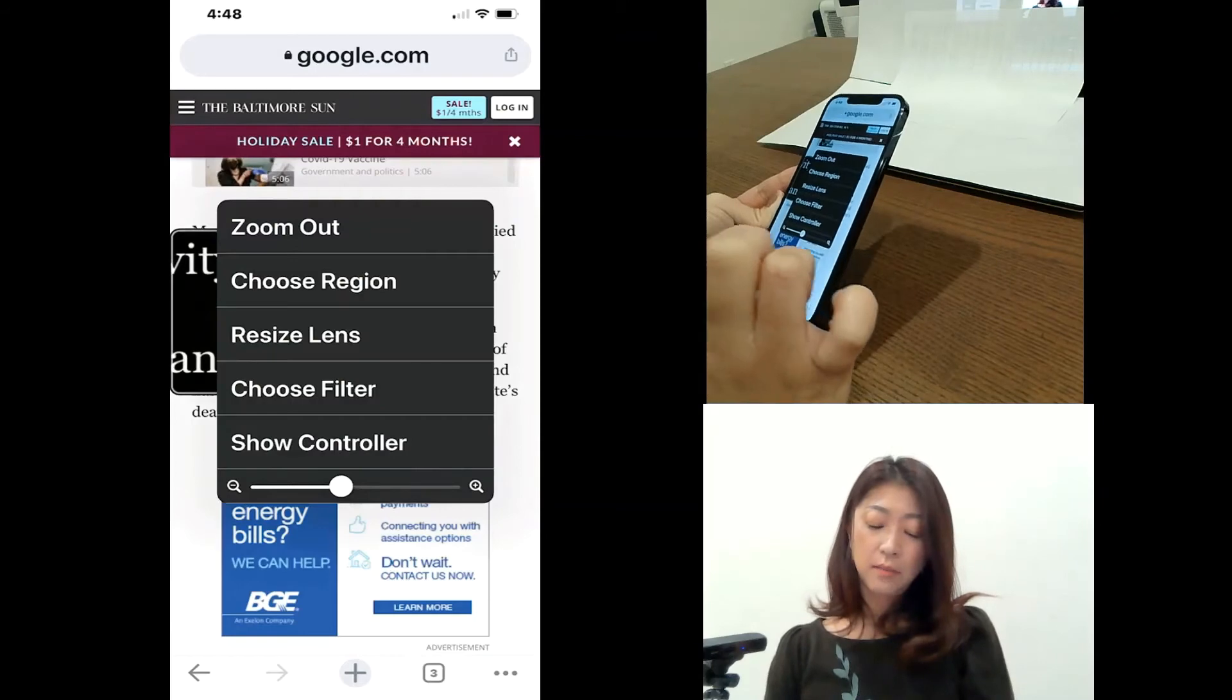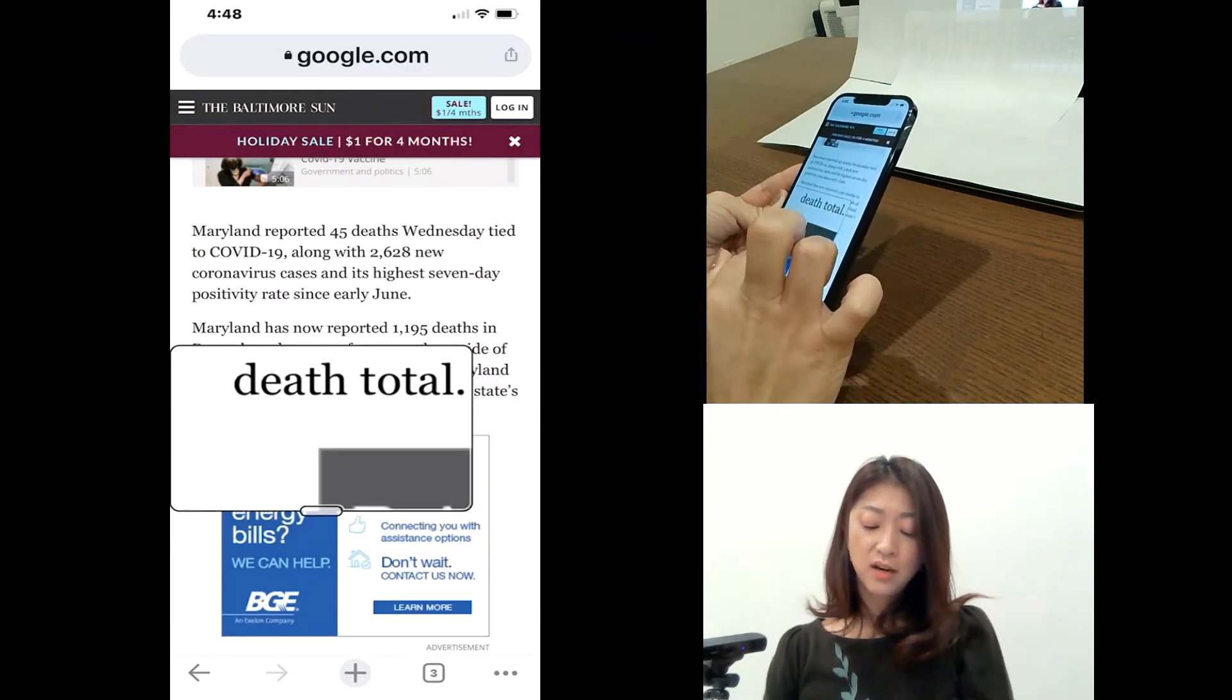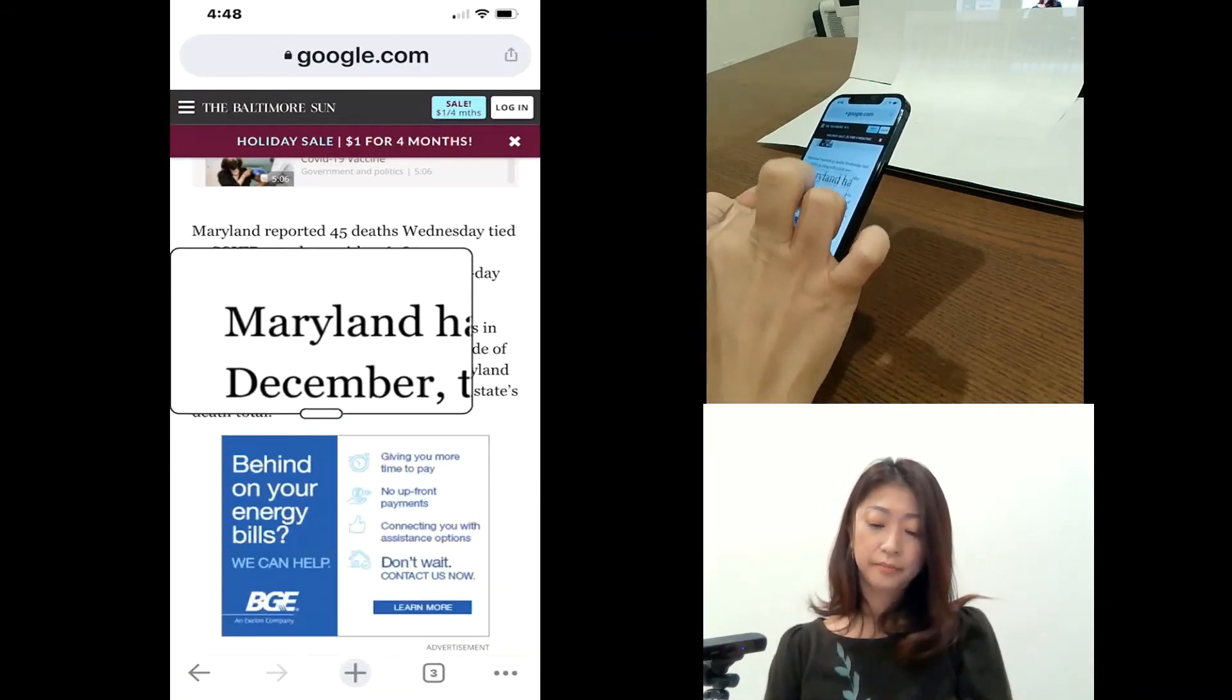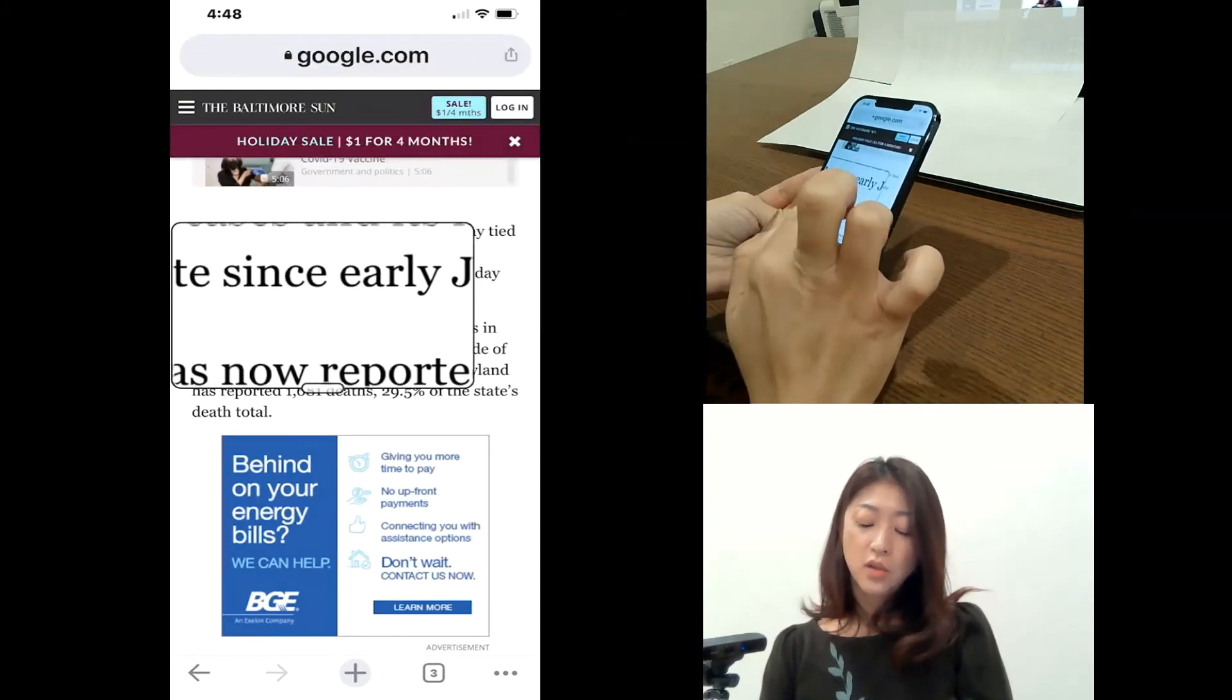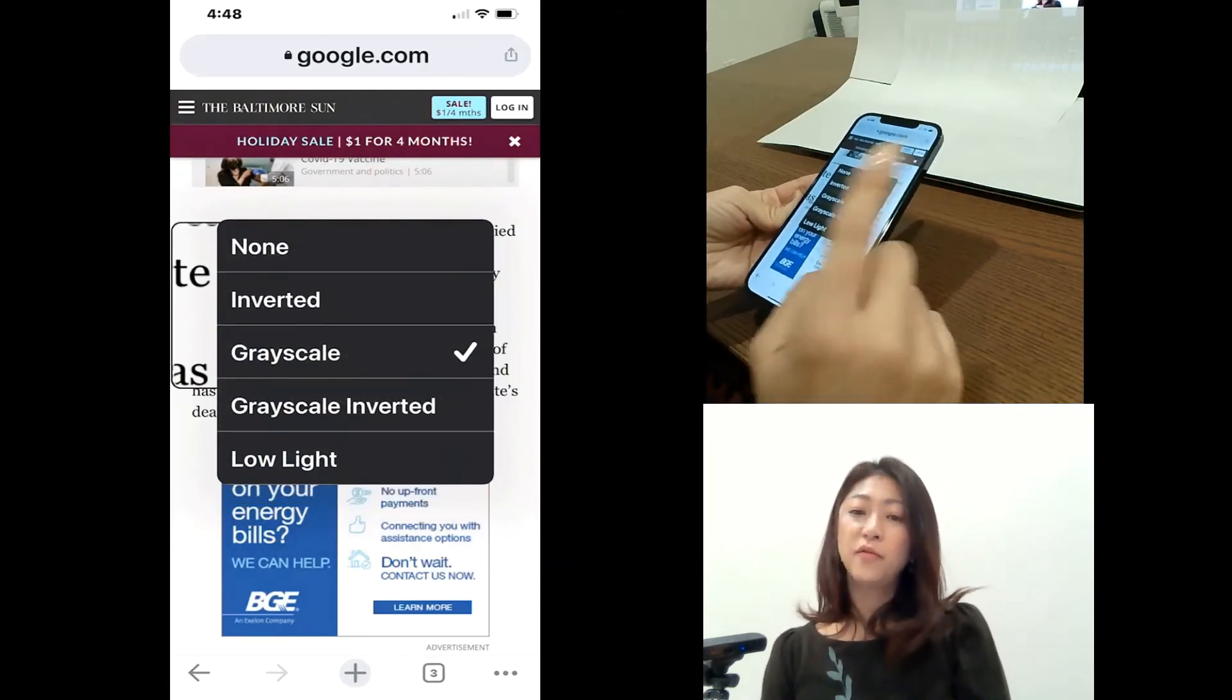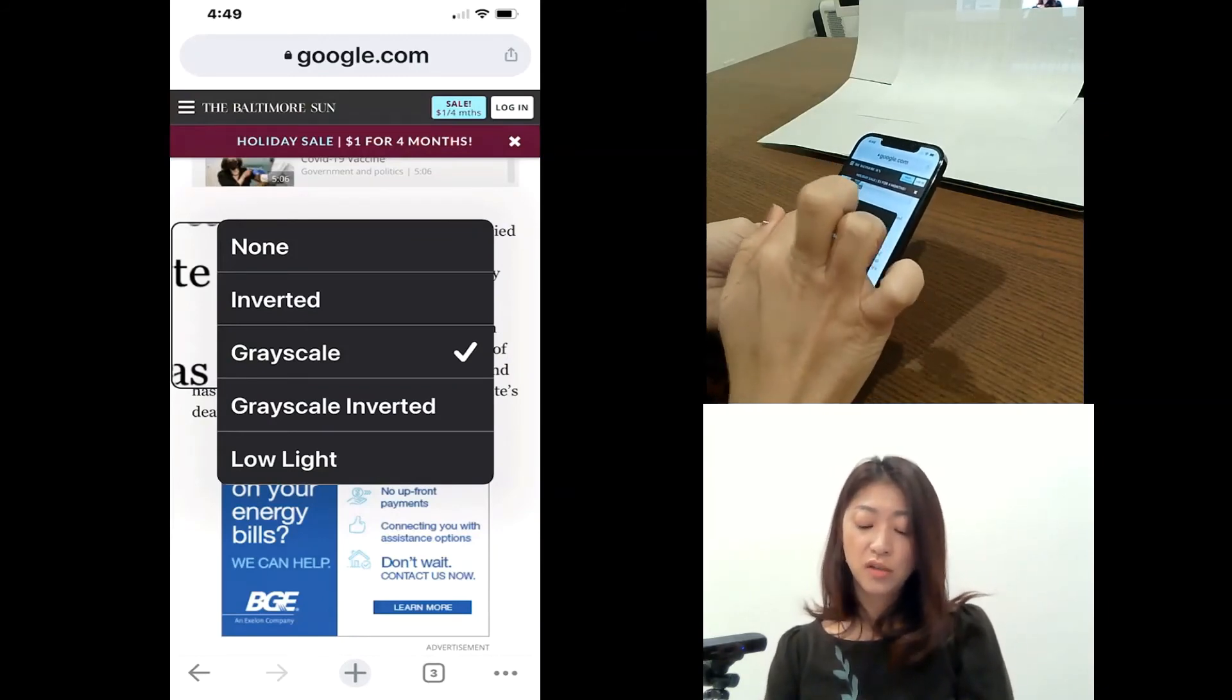And then let me go back and choose grayscale. And now what you see here, it's all black and white without any color. Okay. So I usually recommend to just try different color filters to see if one filter works better for you than the other one. For now, I'll just choose none.